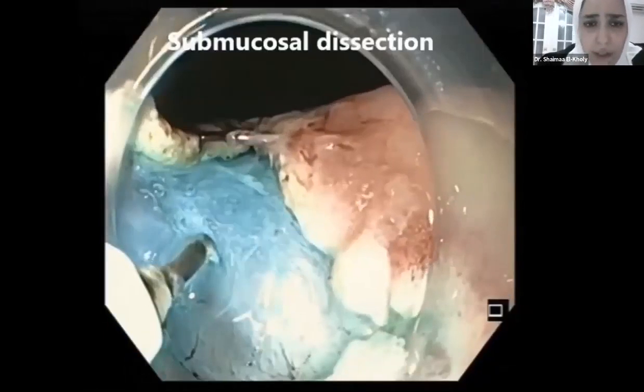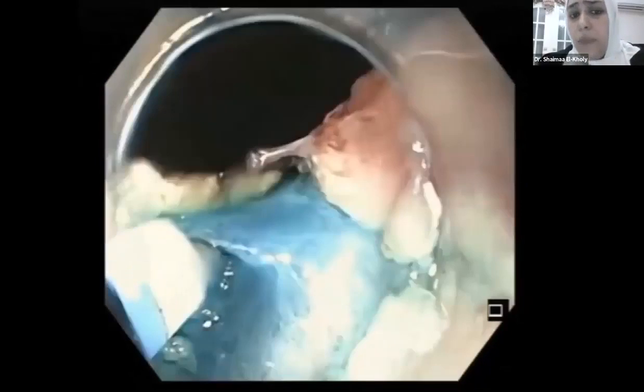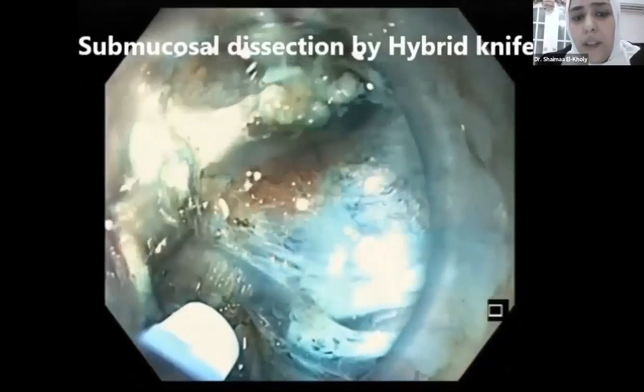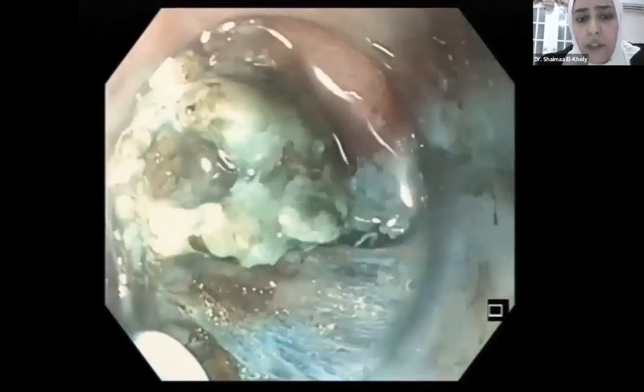Then we start dissection. You can see here the submucosa looks blue. I hope you can see the video clearly. And then we go below the lesion where we go for dissection. The lesion is on the left side. And we are just below the lesion and we are dissecting now. The submucosa has a very good affinity for the color. So it is the blue layer.